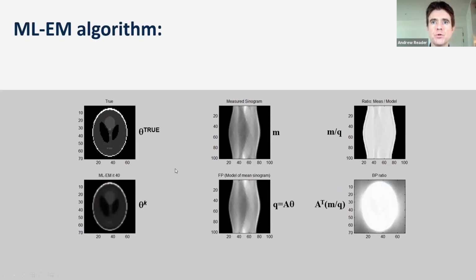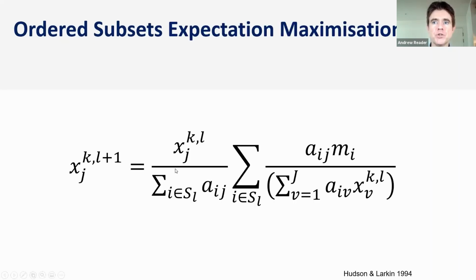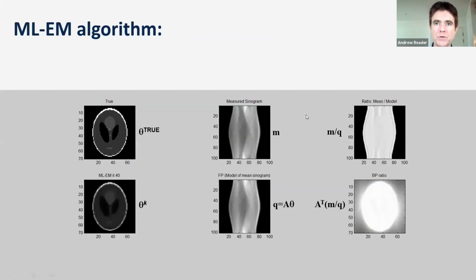So a very straightforward method. Just to add further, the drawback with this is that you'll see in the forward model, we have to forward model into the entirety of the data. Now in 2D, that's fine, but in 3D, you're typically dealing with approaching 1,000 sinograms, and that can be slow, although these days, even forward projection into 1,000 sinograms is pretty quick.